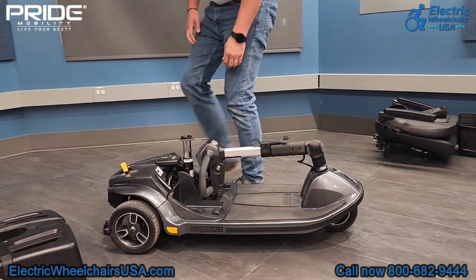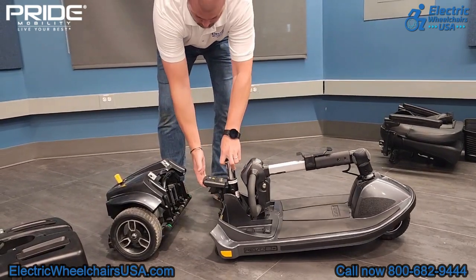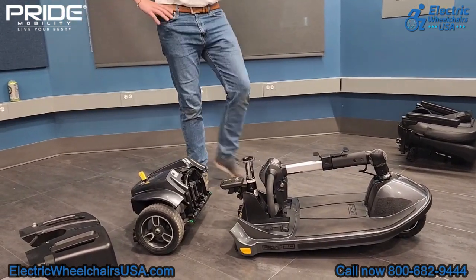And lastly, there's a lever right behind the seat post. You just lift that up, and that will separate the front half portion of the scooter from the rear wheel assembly. And that's how you would disassemble the scooter. Now to reassemble, it's equally as easy.